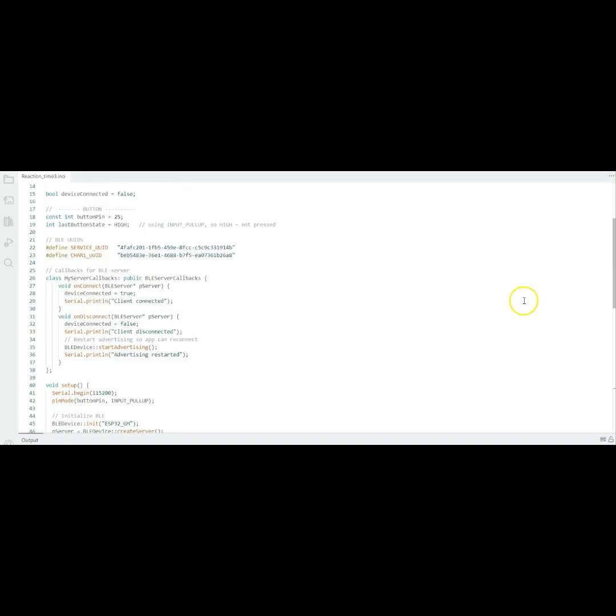These are going to be our Arduino codes. The first code will be for our first ESP32, which is for the reaction time test. We include the BLE libraries, and we make sure that there's nothing connected. For the push button, we're using button 25. We set it as high at the beginning, so that means that the button is not pressed.